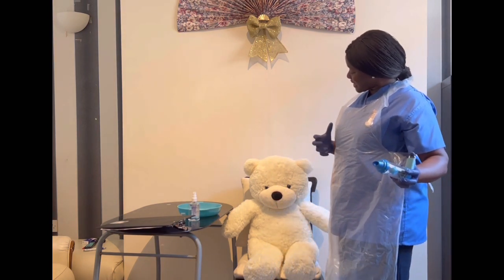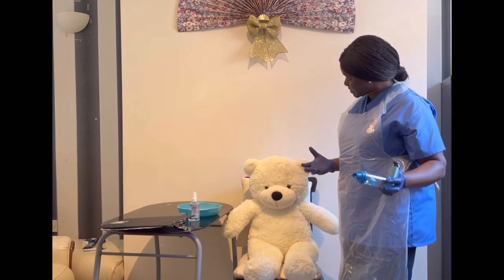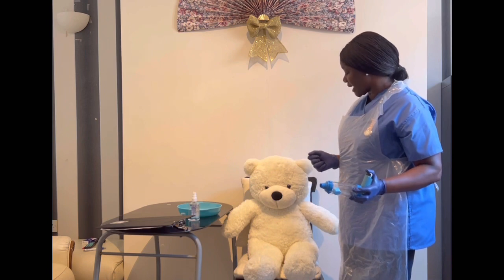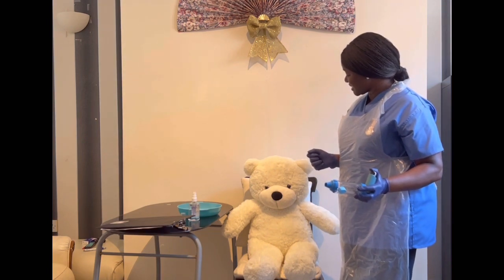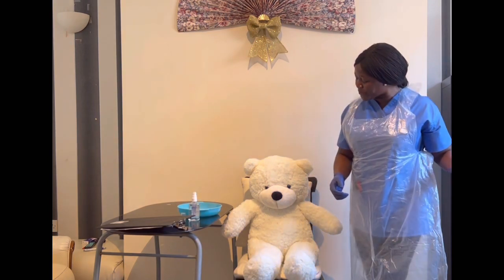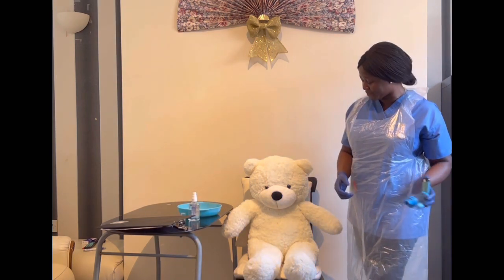Can you try to hold your breath for 10 seconds or as long as your capacity can carry? Okay. 5, 6, 7, 8, 9, 10. Wonderful. Can you breathe out slowly through pursed lips?